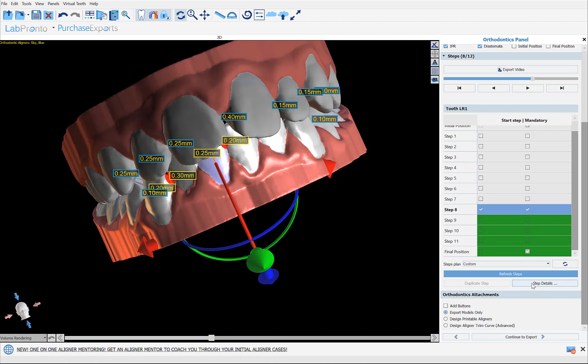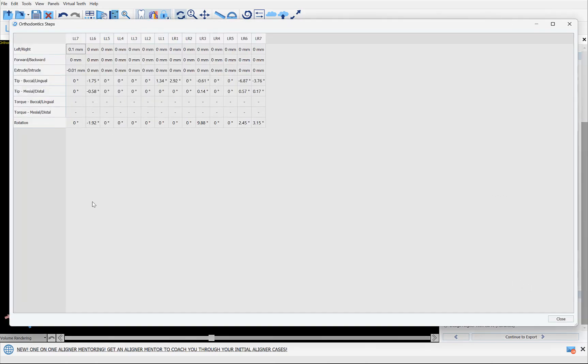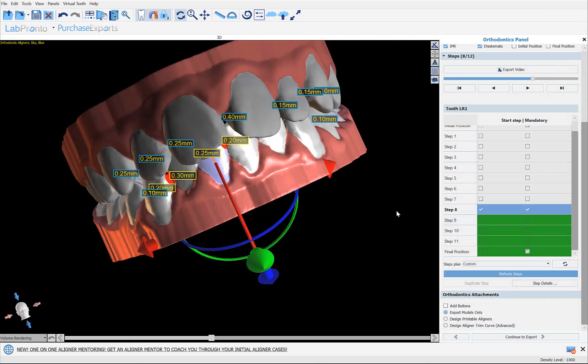A final point: you can click on Step Details, which shows you for each tooth what the movement was for a particular step and what kind of movement occurred. If you want to change the limits of how much a tooth can move or rotate in a particular step, that capability is available under Tools and Options — though we won't get into that detail in this tutorial video.